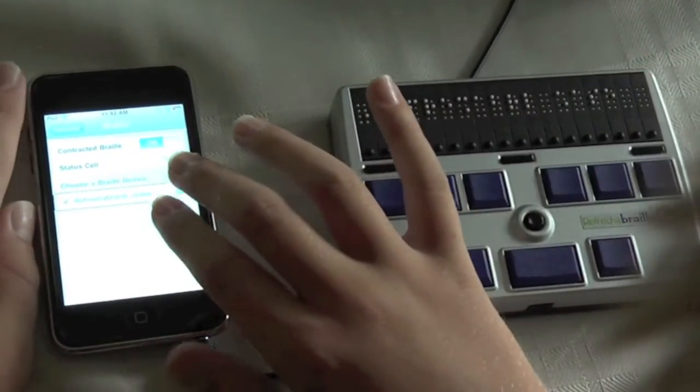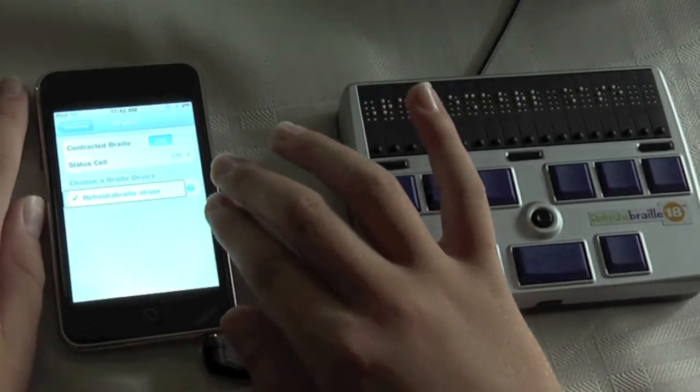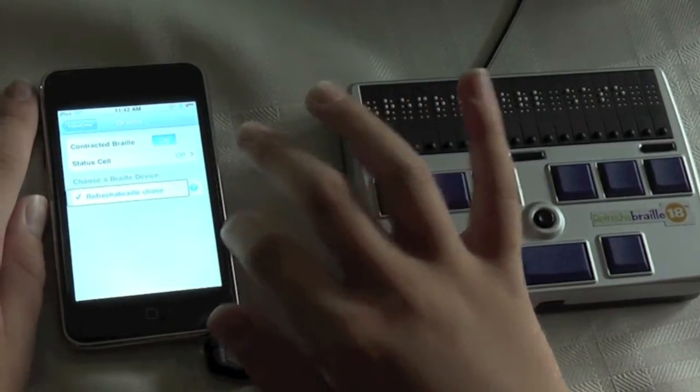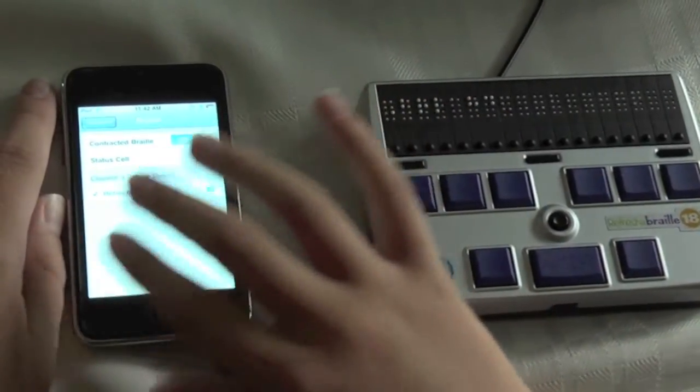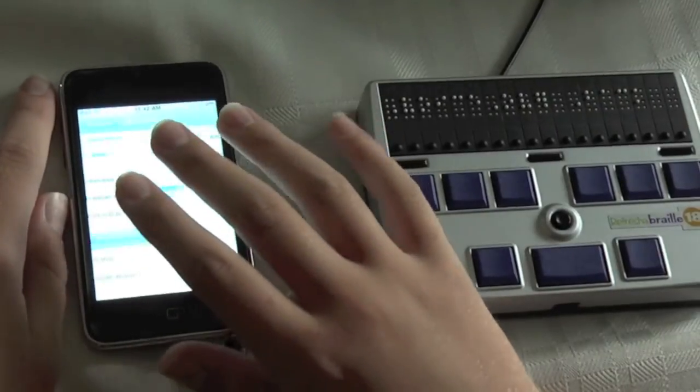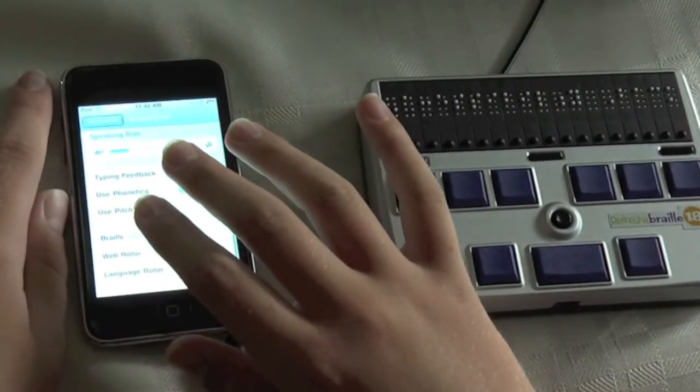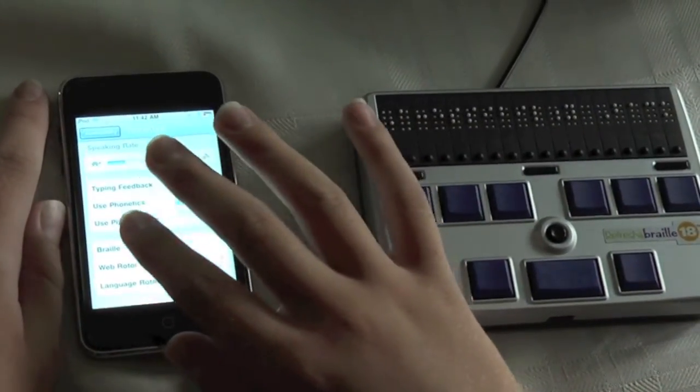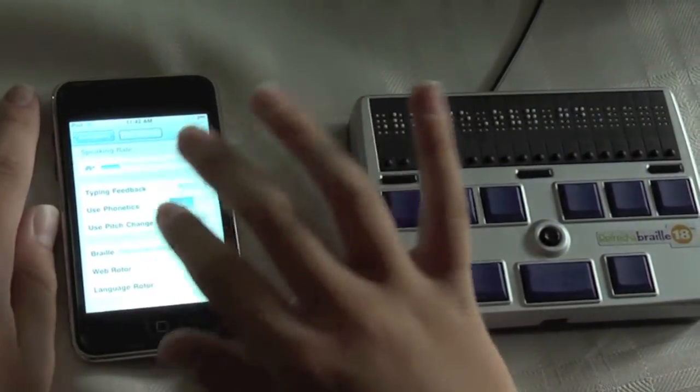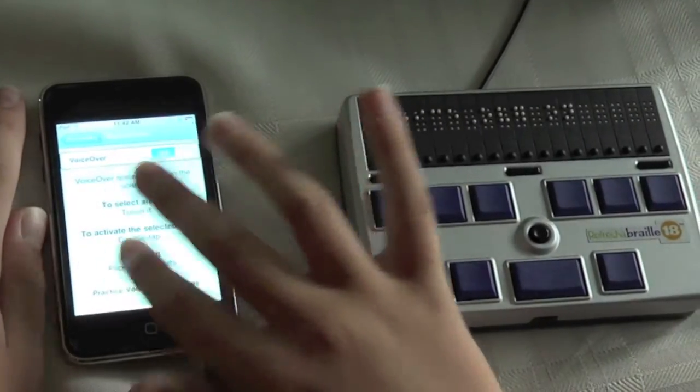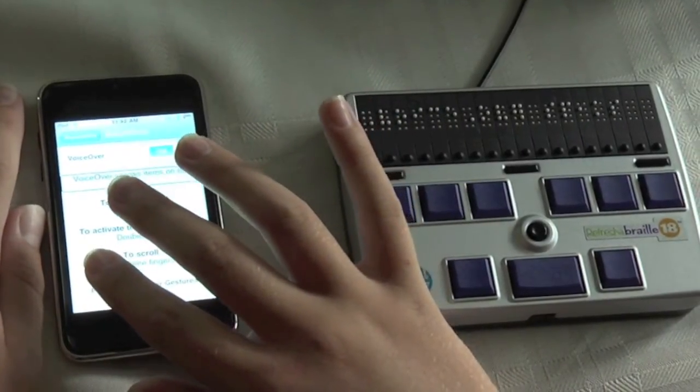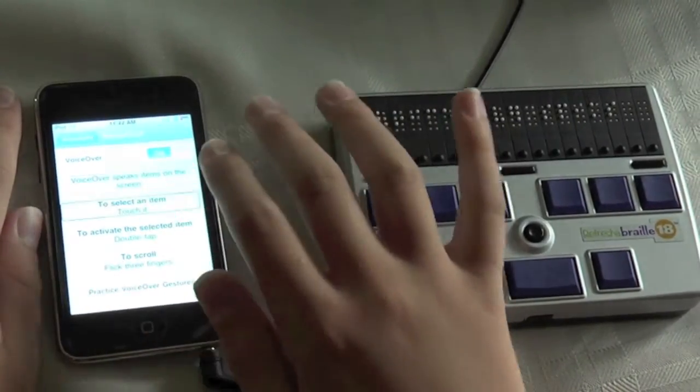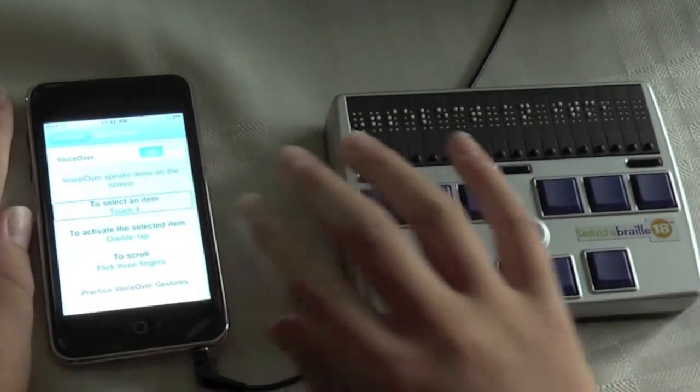Now what I want to do is go to the Practice VoiceOver Gestures which is in the VoiceOver Settings. So I'll flick to the left until I get to the VoiceOver Back button. And now we're back in the VoiceOver Settings screen. VoiceOver speaks items on the screen. To select an item, touch it.